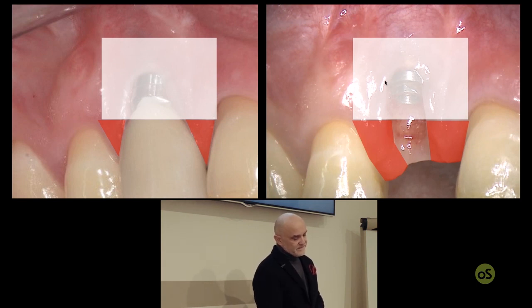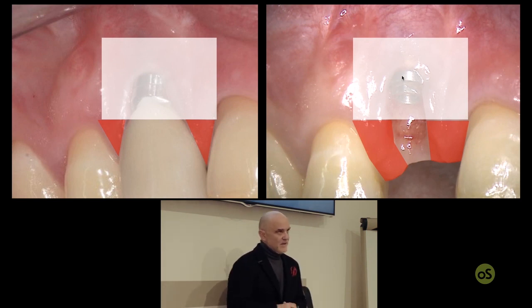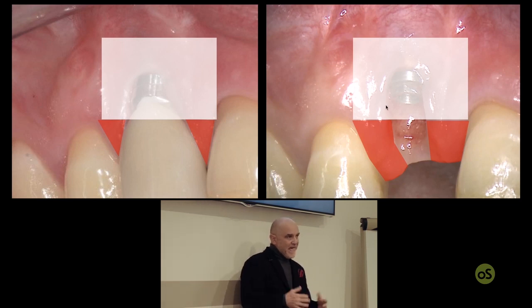You see that here the abutment was temporarily removed before starting the surgical procedure, because it's easier to manage the flap for covering the graft with no abutment.